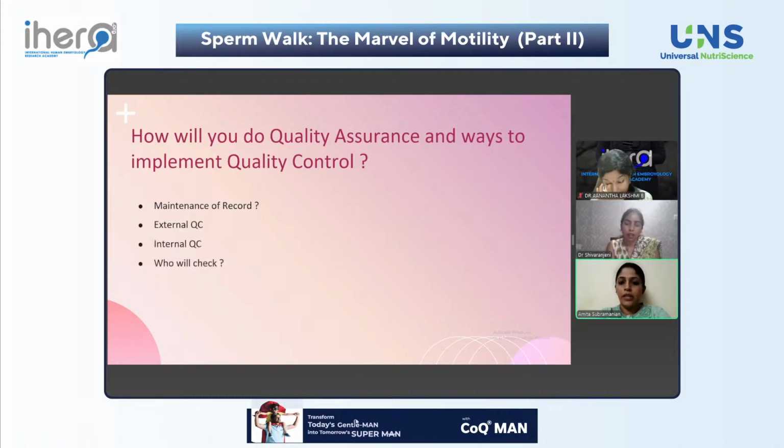Do you do external quality control with respect to sperm motility? Yes. How is it done? So we have another person from the other centers, and they will randomly come on days and check. So it is better.